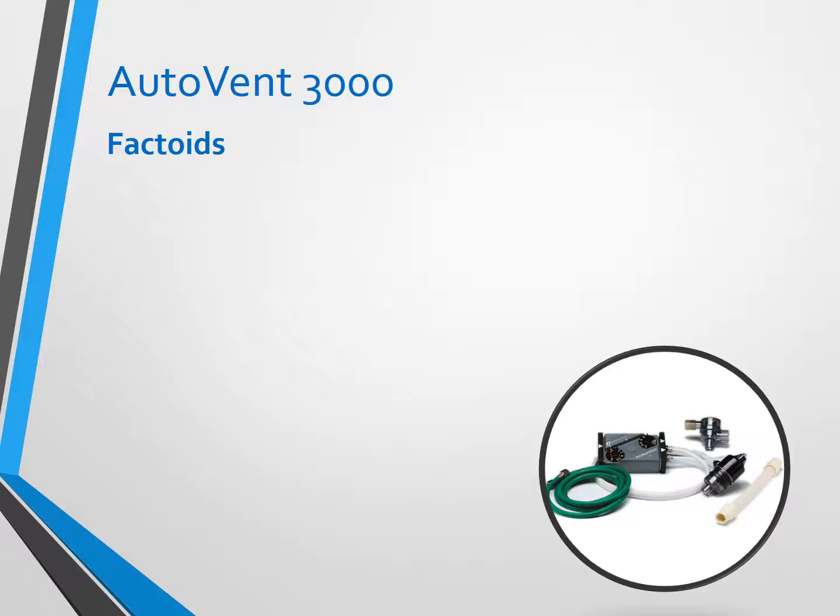It's time-cycled, not pressure-cycled. It's gas-powered, meaning that oxygen is what drives it. You don't need to plug it in and you don't need battery power. You're going to find this on the supervisor trucks for EMS-1 and EMS-2.